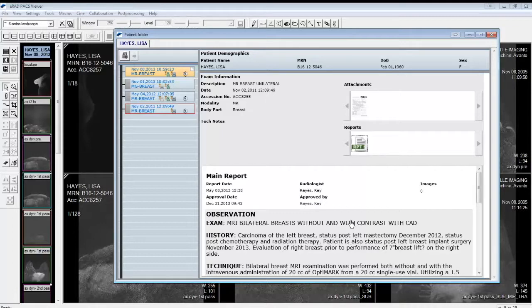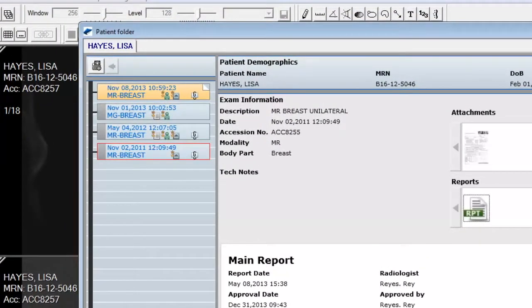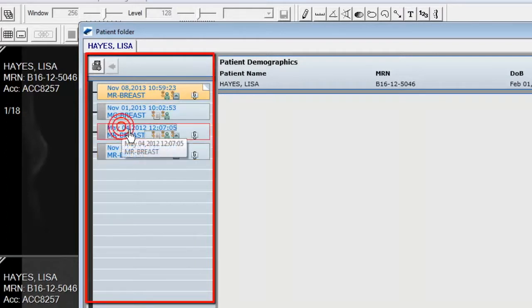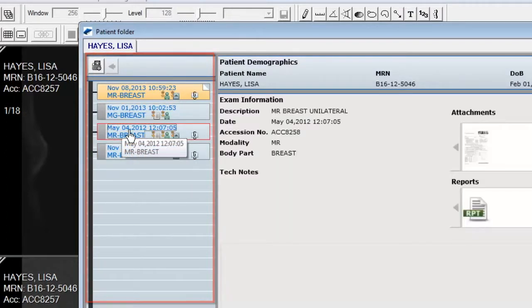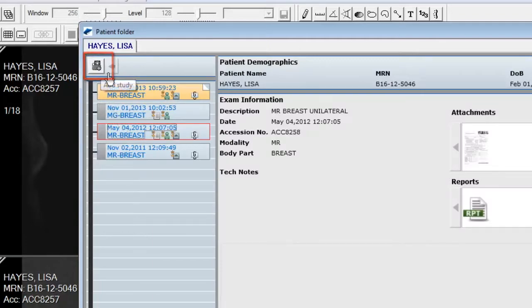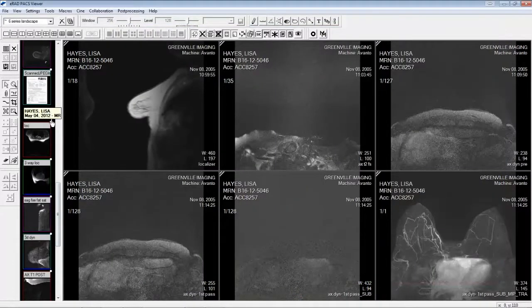To open a prior study from the patient folder, do the following. Find and select the study from the timeline section of the patient folder by clicking on the blue hyperlink text. You will notice a red border around the item when selected. Click the add study icon located just above the timeline. Notice the study will now load into the viewer's thumbnail panel. Here is the study we just loaded from the patient folder.